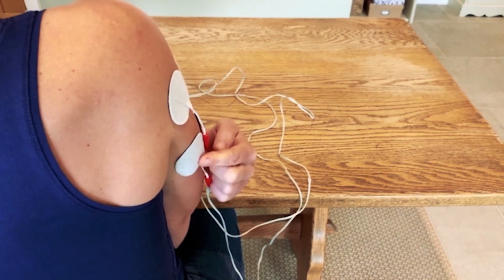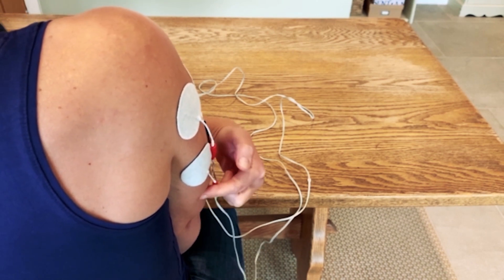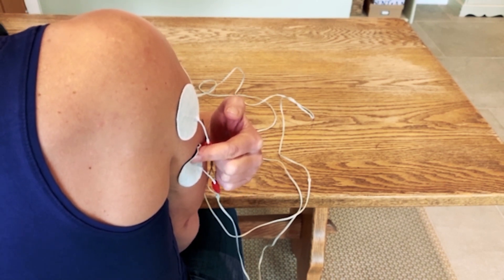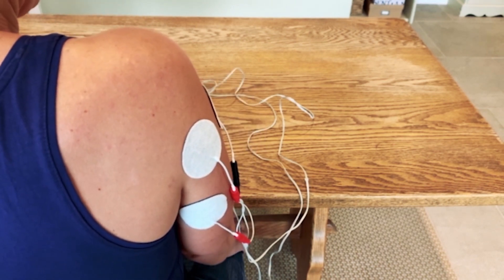The fourth electrode goes on the long head of triceps — that's just at the top of the upper arm, just beneath this electrode. That's setup number one.